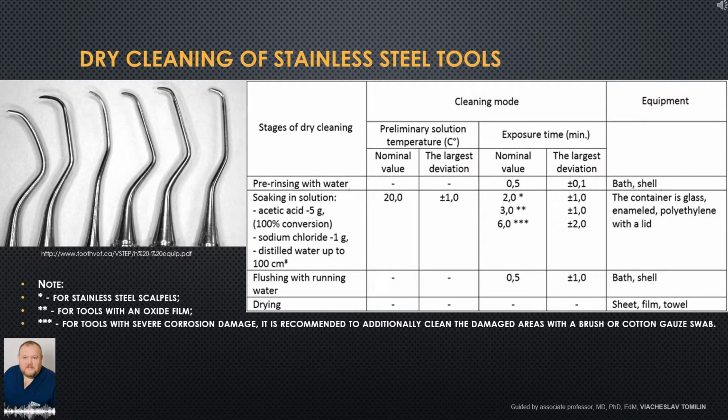There are stages of dry cleaning. Cleaning mode. Preliminary solution temperature. Exposure time.